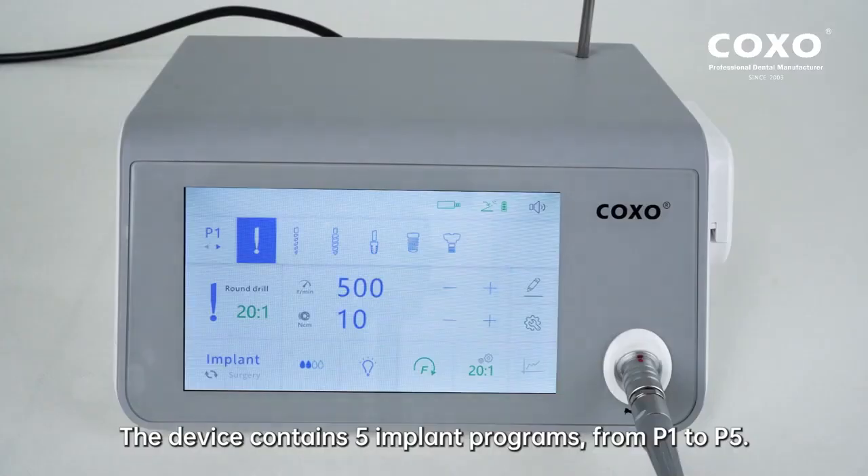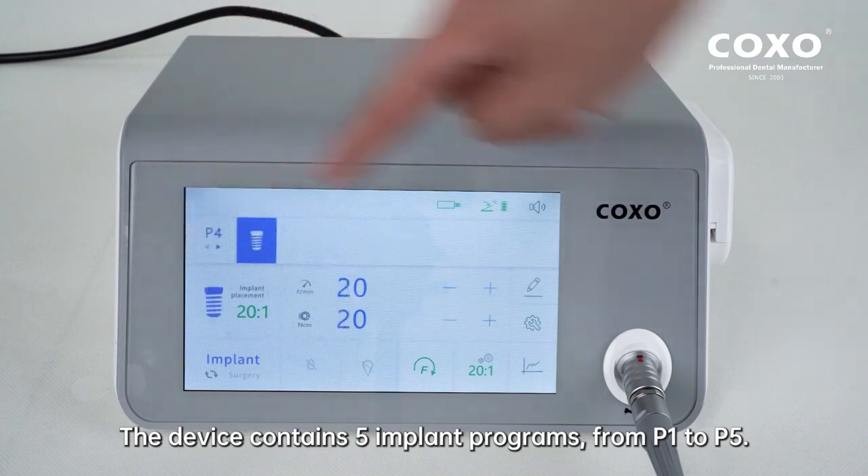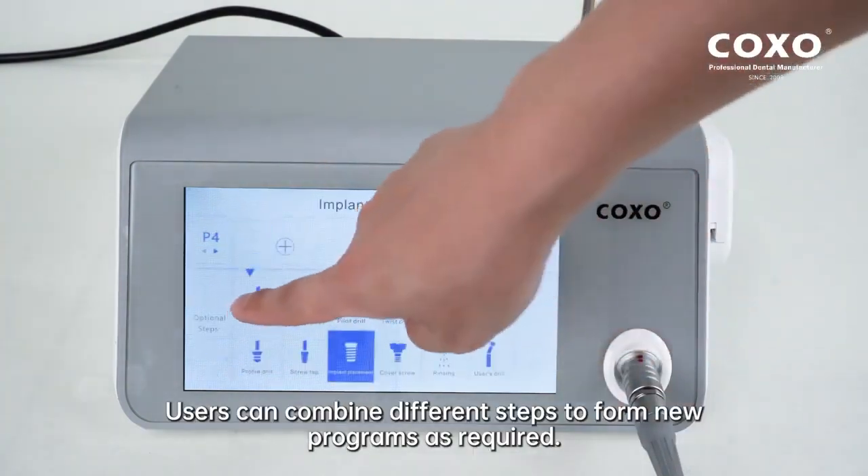The device contains five implant programs from P1 to P5. Users can combine different steps to form new programs as required.